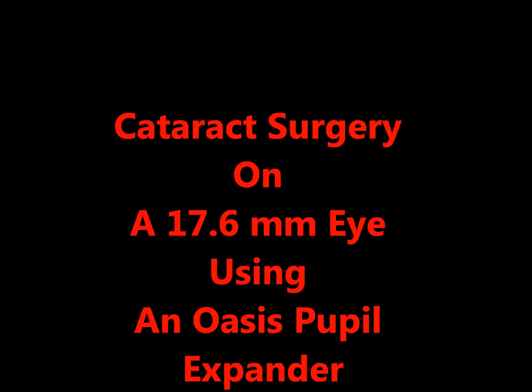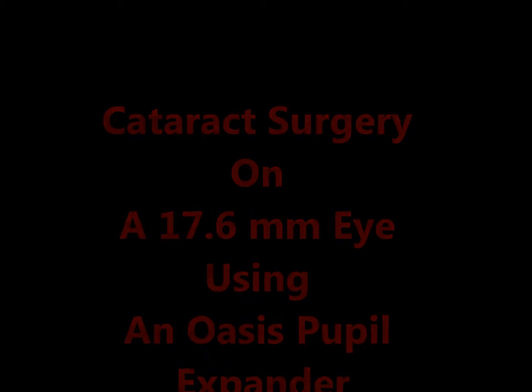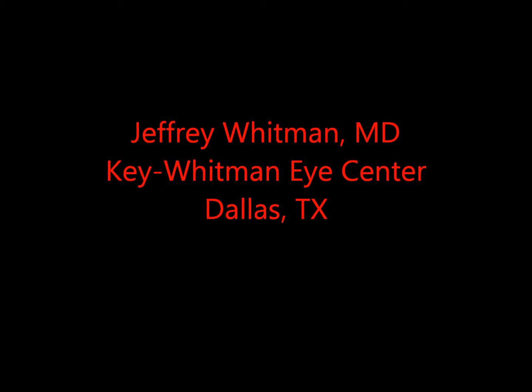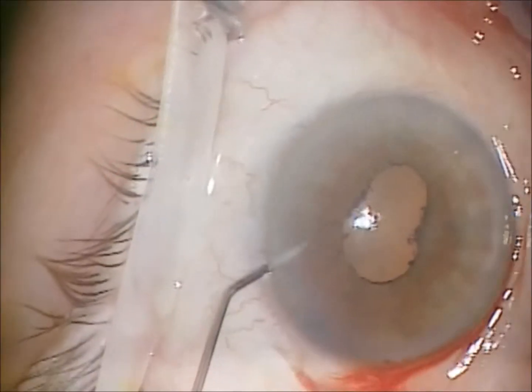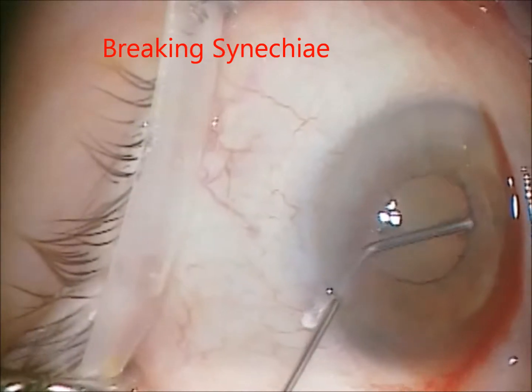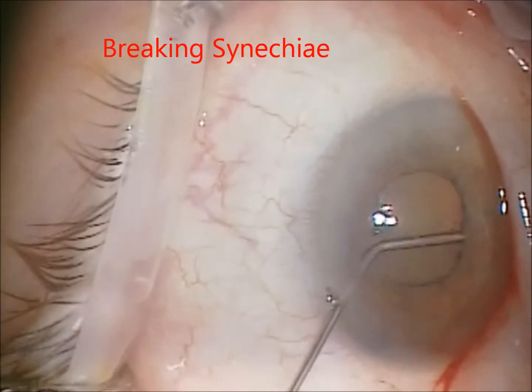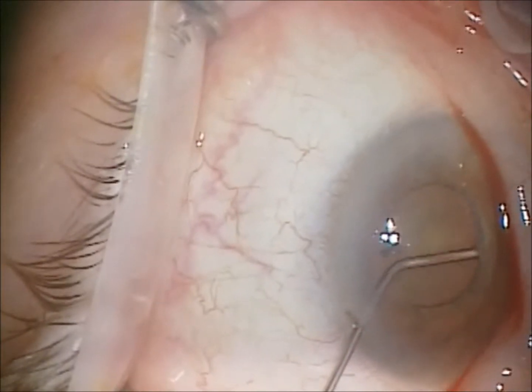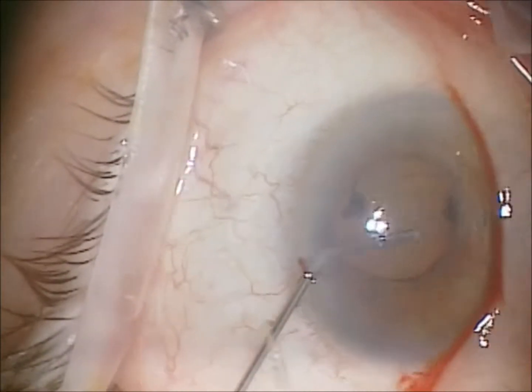This is Dr. Jeffrey Whitman of the Key Whitman Eye Center in Dallas, demonstrating cataract surgery on a microphthalmic 17.6 millimeter eye. This was the case binocularly in the patient, and as you can see there's synechiae that needed to be broken with the viscoelastic cannula.